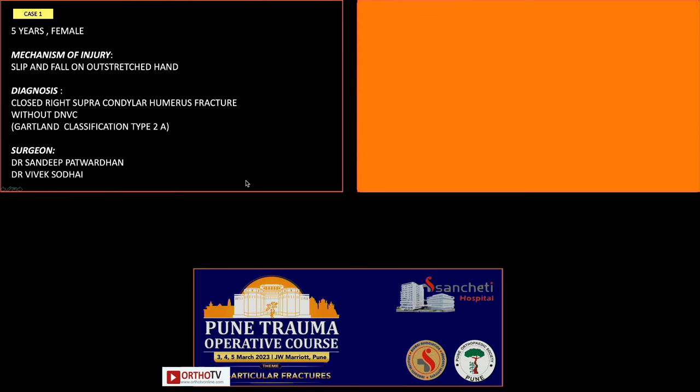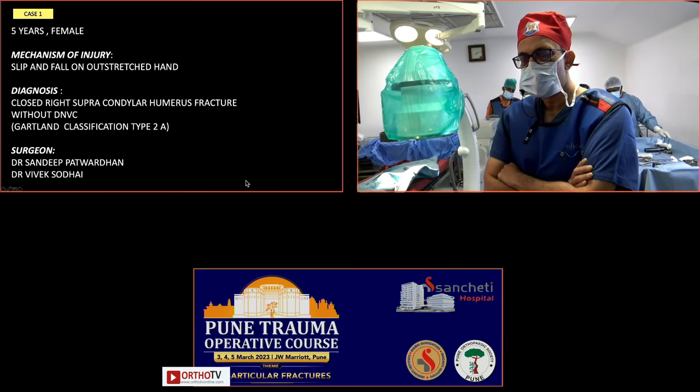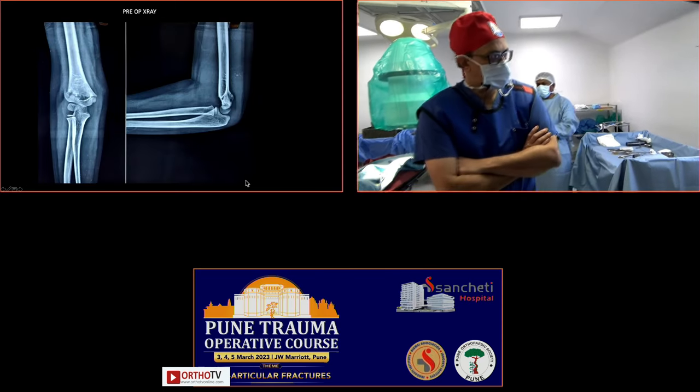She's a 5-year-old female, had a slip and fall on an outstretched hand, diagnosed with closed right supracondylar humerus fracture without neurovascular compromise. Surgeons for the case are Dr. Sandeep Patwardhan and Dr. Vivek Sodhai. So this is the X-ray.